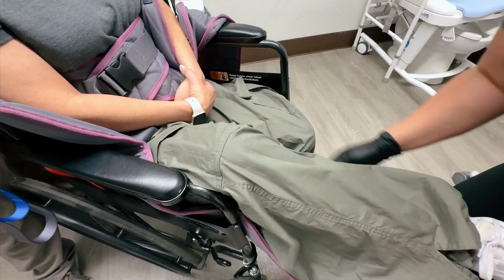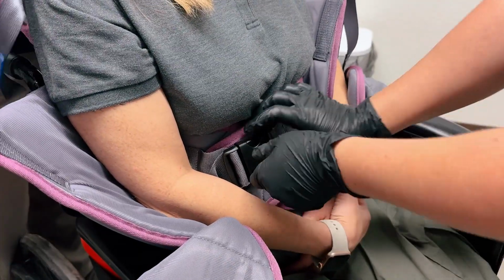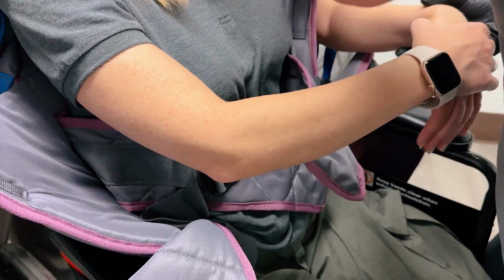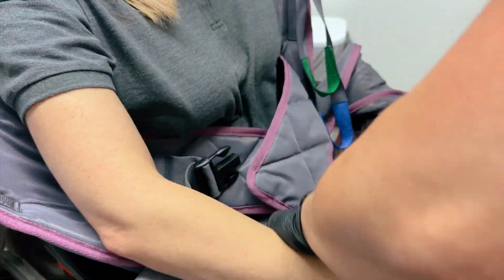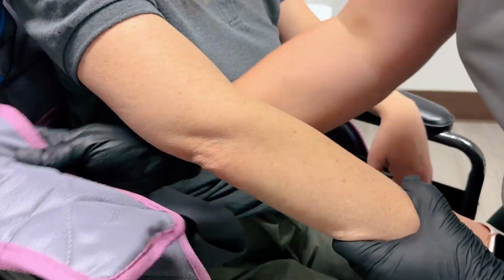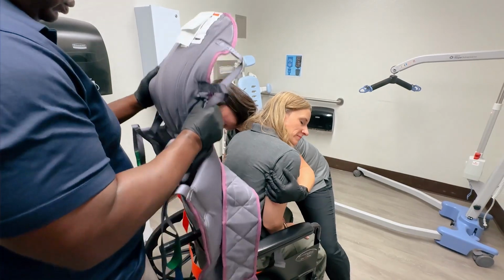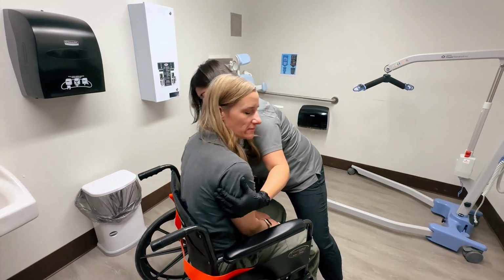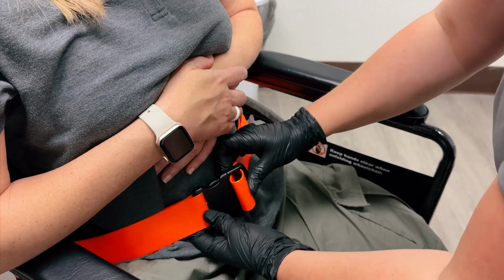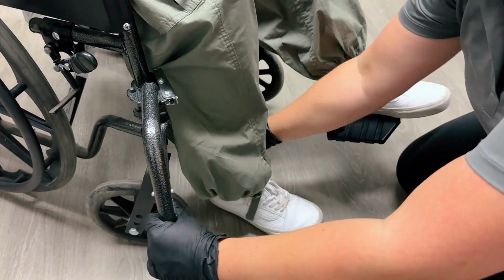With the student sitting in a wheelchair, one assistant in front of the wheelchair and the other assistant behind the wheelchair, return the wheelchair to an upright seated position. Have the student lean forward so that the front assistant is supporting the weight of the student. The back assistant will remove the sling. Lastly, secure the wheelchair seatbelt and all other wheelchair supports and fasteners for the student to be secured safely in their wheelchair.